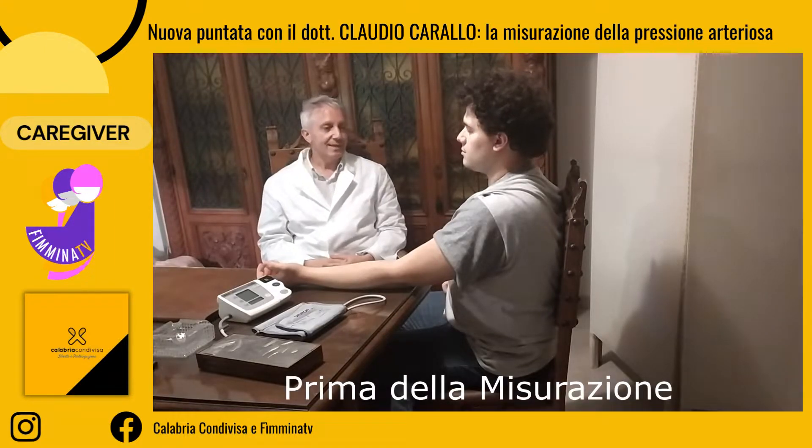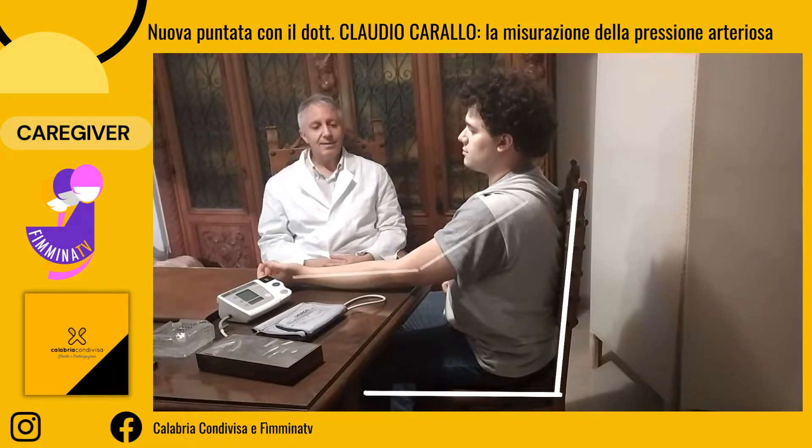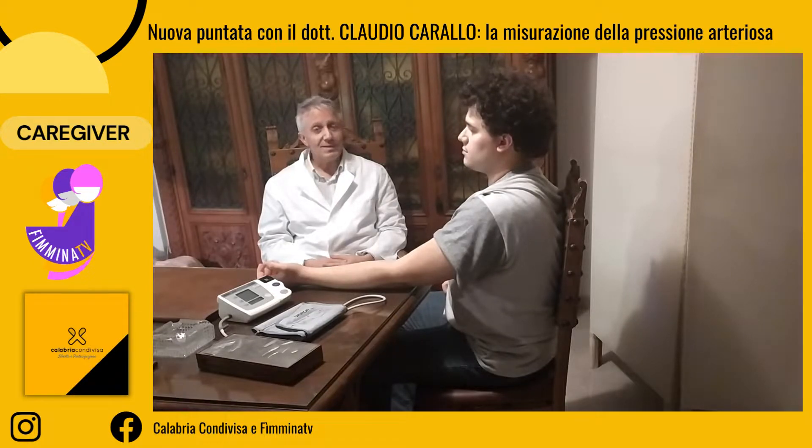Vediamo subito la posizione del paziente, che deve essere comodamente seduto, con la schiena appoggiata e il braccio di misurazione rilassato. Questa posizione deve essere mantenuta almeno per 3 minuti prima di ogni misurazione pressoria, ed è finalizzata a verificare il valore pressorio in relazione a standard noti. In questi 3 minuti il paziente non deve essere impegnato in conversazioni o in altre attività, al fine di raggiungere uno stato cosiddetto basale di valore pressorio, che poi si confronterà con i valori pressori normali.